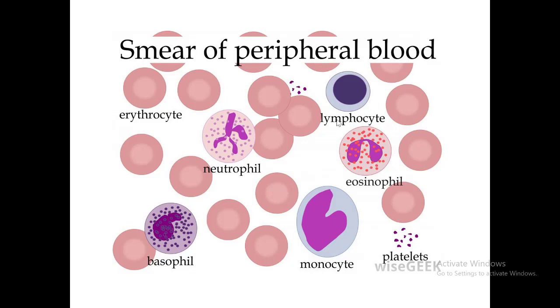Look at this eosinophil, 2 to 4% of the white blood cells are eosinophils. The nucleus is two-segmented, and the cytoplasm is full of eosinophilic granules that have a specific major basic protein rich in arginine, and it's very important in killing helminths. It is a very important cell.